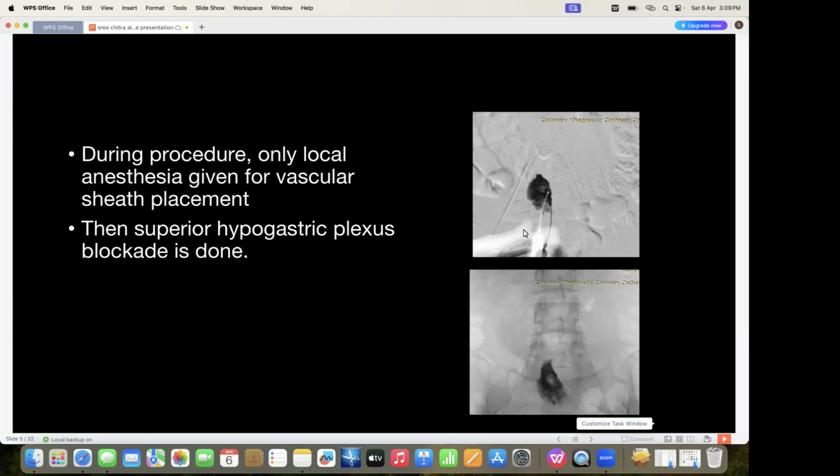While injecting the bupivacaine, we give a slight forward thrust to the needle, so that it doesn't retract and go into any particular vessels. So with this, the procedure is completed. This procedure takes hardly 5 to 7 minutes, but it really works, especially in the post-procedure period, to relieve the pain for the patient. So this was the first thing done.